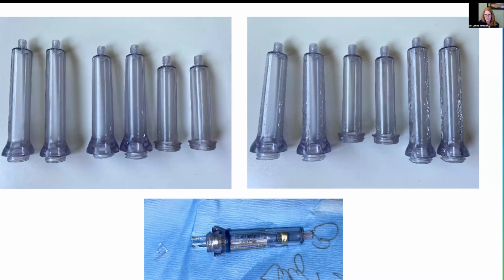So this on the screen is what the container should look like. When they start showing these little spidery things, that's when you need to replace them. I pushed the limit, pushed the limit, pushed the limit, and of course had a visiting doctor when this happened. First friend of the day, and they had a few of the little spider web things, and I heard this clink, and all of a sudden glass was all inside the container. It doesn't come out of the container. It's perfectly safe for the child.